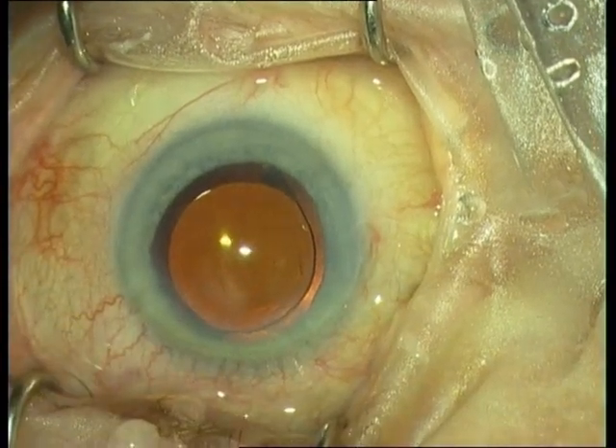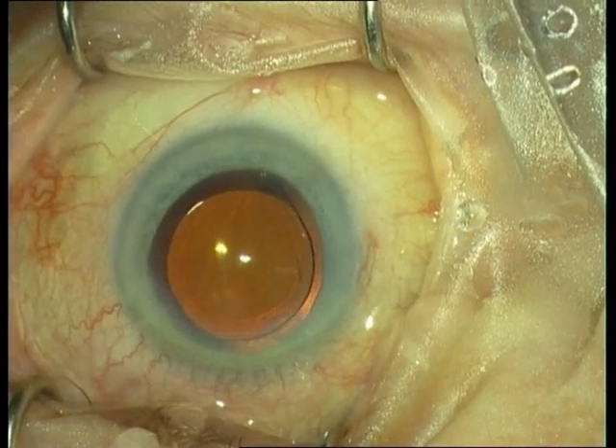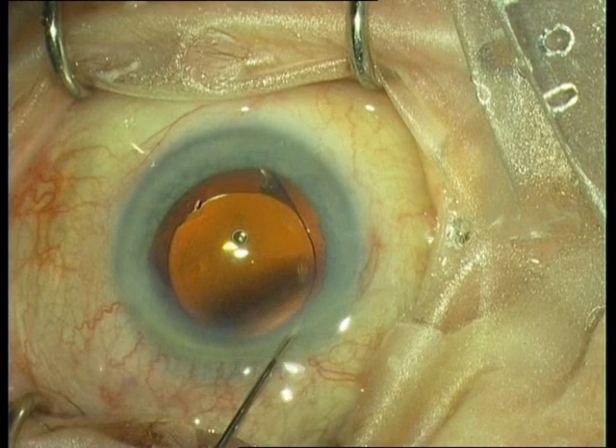Always double check that both haptics are located inside the capsular bag. The final step is removal of the viscoelastics, then injection of Cefuroxime as an endophthalmitis prophylaxis, and finally hydration of the paracentesis.